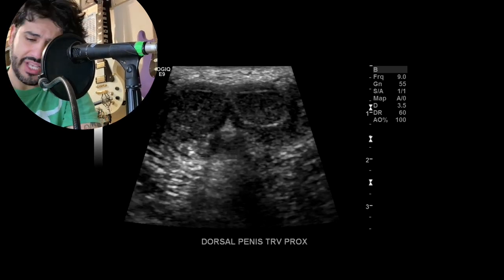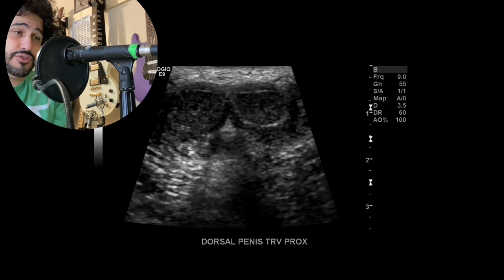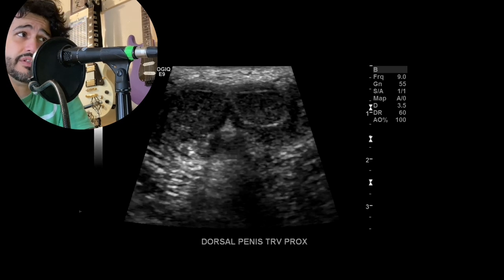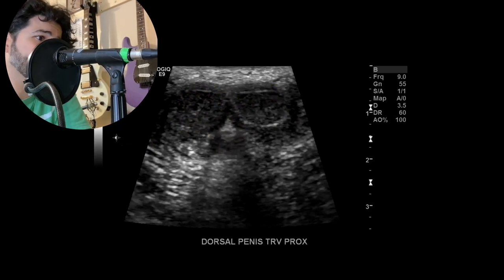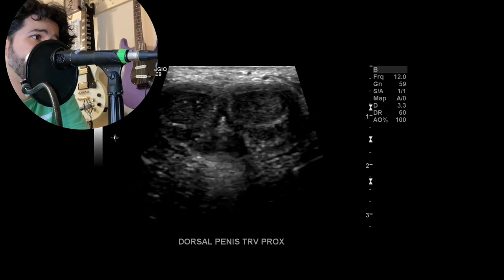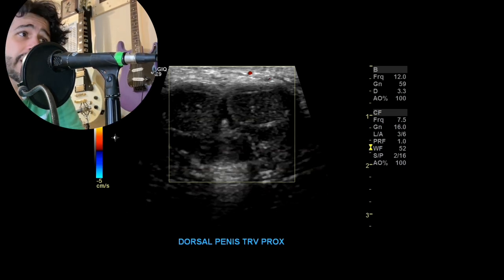I begin on the dorsal side of the penis. In the anatomical position with the penis pointing normally, the dorsal is the aspect you see. I start there proximally — that's towards the mons pubis or towards the body — and you can see the two corpus cavernosum and the corpus spongiosum. I label it 'dorsal penis transverse proximal' and take a couple pictures. You can use either a 15 or 18 megahertz probe. Then I add color doppler — this exam was to rule out penile fracture, so you want to make sure there are no abnormal collections.